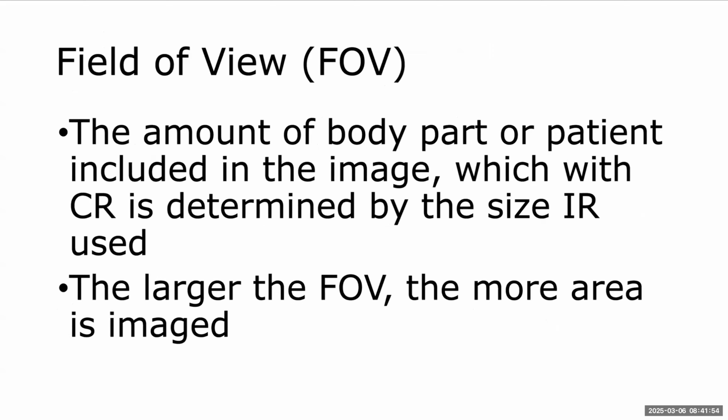Field of view, this is when we're still talking about CR, computed radiography. The amount of body part or patient included in the image, which with CR is determined by the size of the IR. So this is different than when we talk about a collimated field. It's not the same thing. In CR, the field of view is determined by the size of the IR that you're using. So the larger the field of view, of course, the more area you can image.